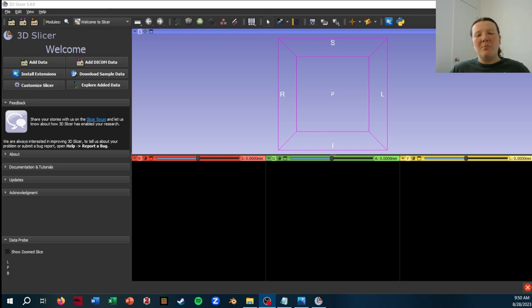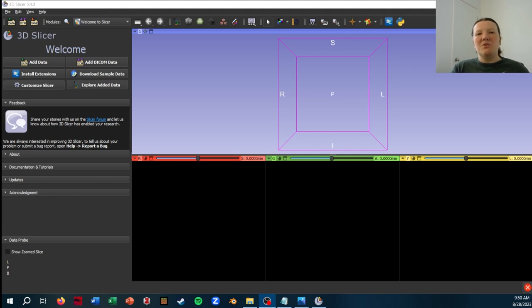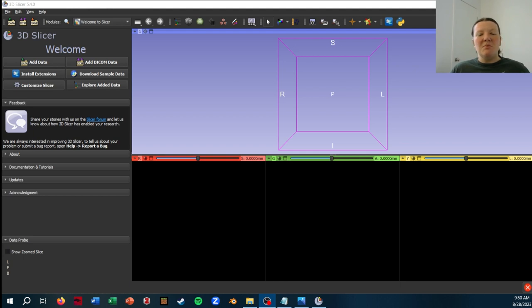Alright, so following up to my video from last week, I'm going to be going over how you can take the 3D landmarks you placed in Slicer and use SlicerMorph to do the preliminary steps of geometric morphometrics.